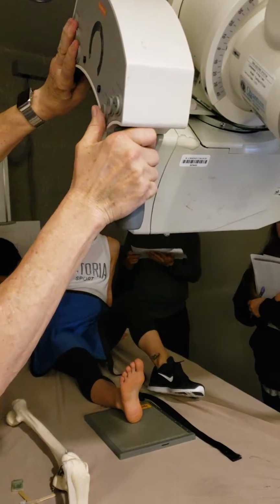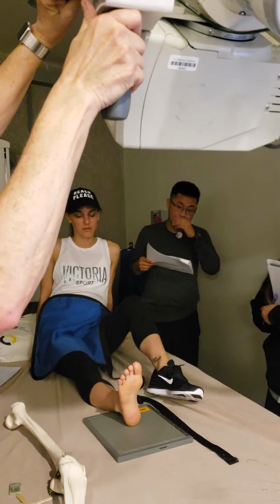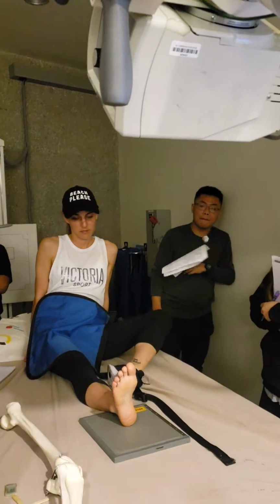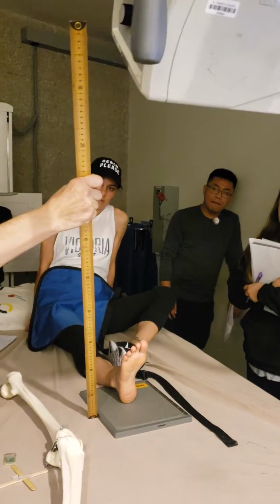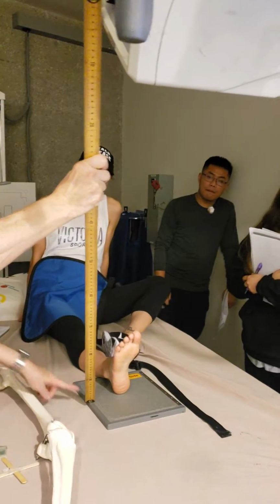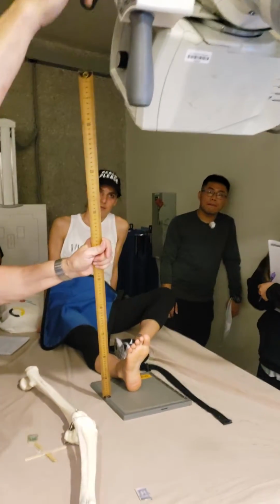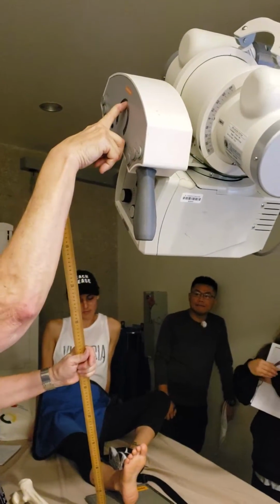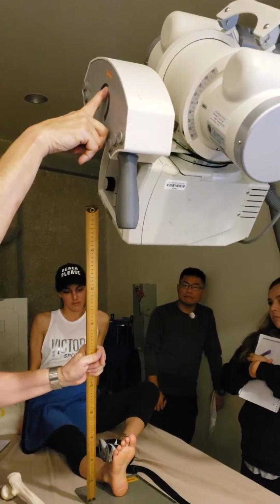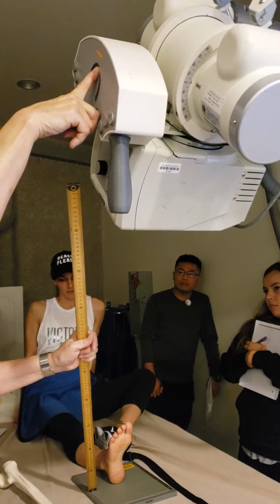All right, so remember I said if you stay at 40 inches here, that's not going to work because this distance has to be 40 inches to the tube. And the way you measure the 40 inches is you hit the middle of the cassette here, about right here where the angle indicator is. That's about where the anode is located. Right now we're at probably about 50 inches.